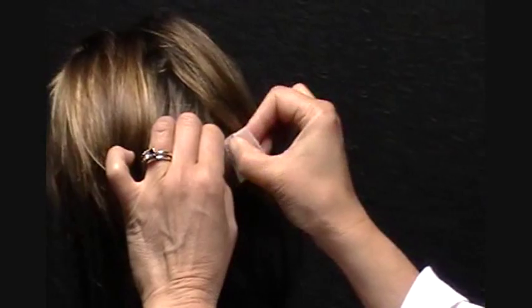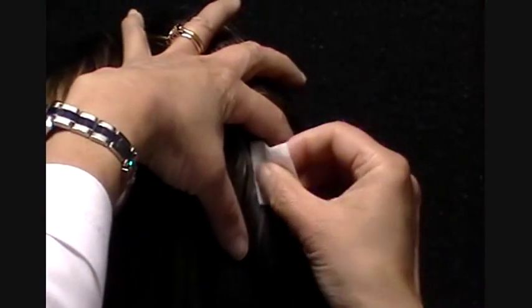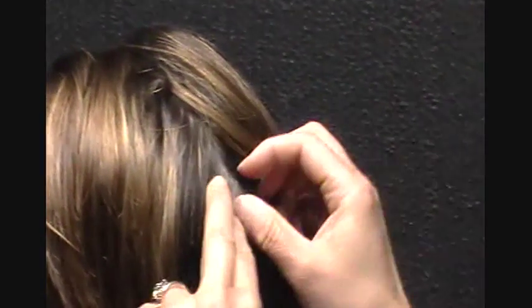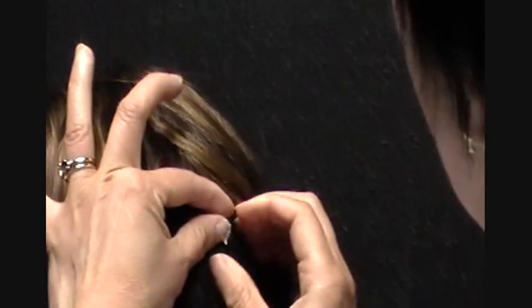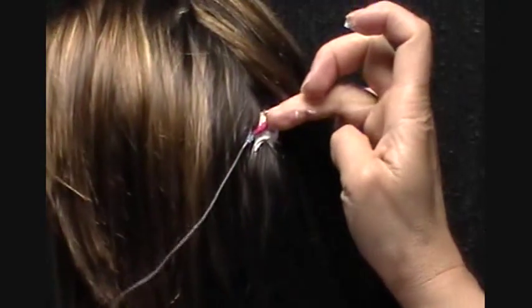We're going to find an area where there's not so much hair, then separate it with our fingers. We abrade it with the alcohol pad. It's okay to see a little bit of pink, because you actually need some sort of contact with the skin. And here is the gel, and here is the electrode. We place it right here, and we're ready to start.